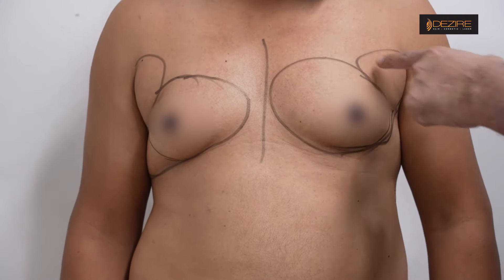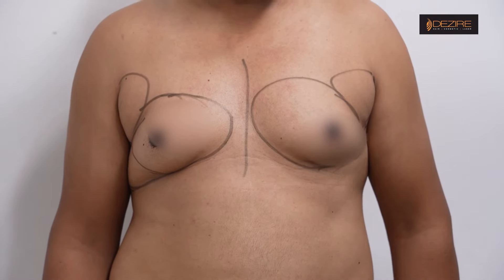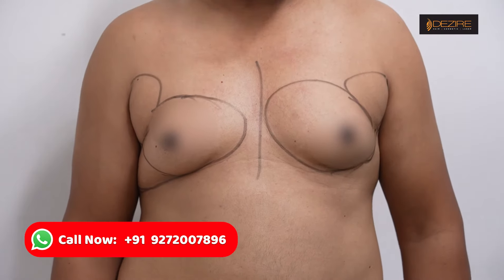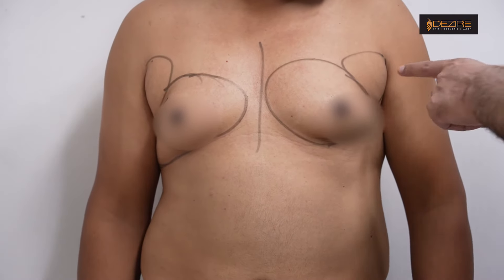We will see here — here is a fold. This is an axillary fold and here is a side fold. Basically, you have to do it here. Fat removal, gland removal — we have to remove this fold.